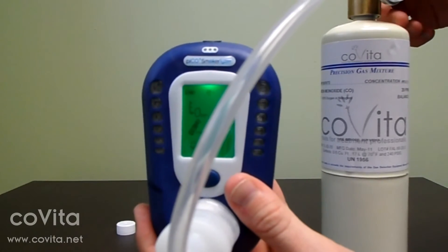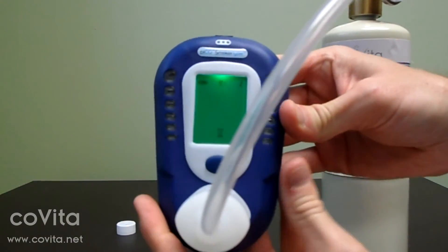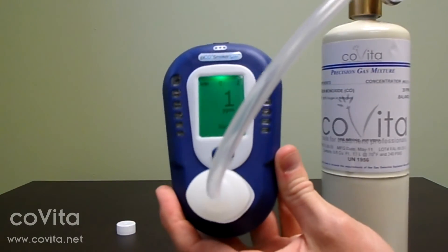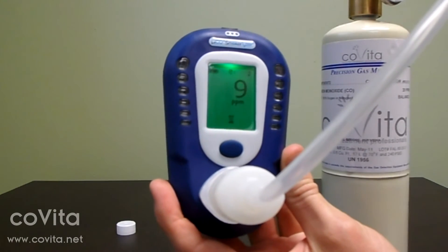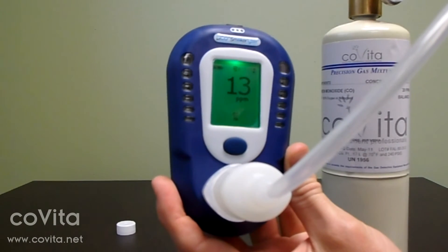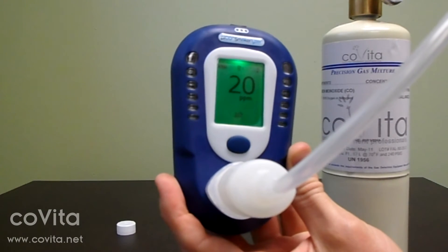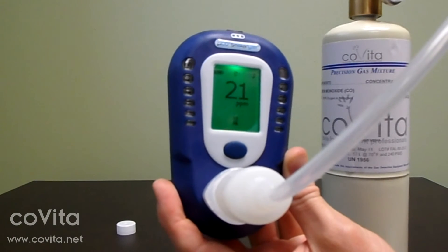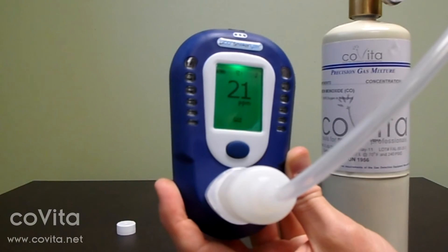Double-click to select the gas icon and begin calibration. Immediately turn on the flow of gas. You may need to adjust the flow rate depending on the type of regulator you have.